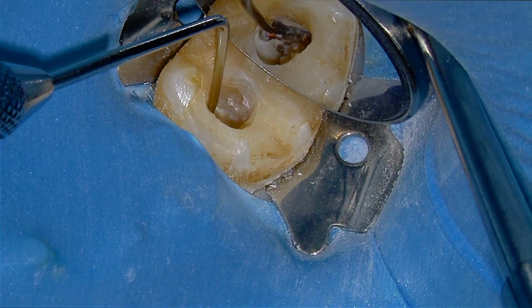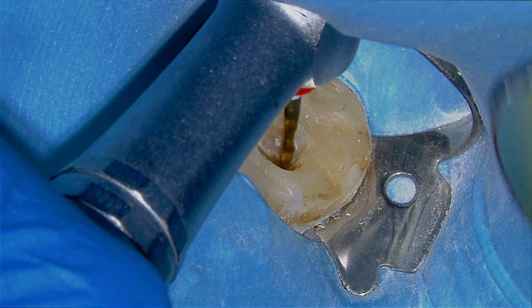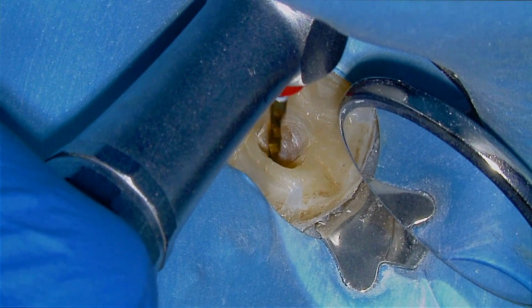It's a really cool tip. Okay, so now what I'm going to do is take my Wave 1 Gold and start to remove some of that gutta percha. But honestly, I find that the reciprocation is fairly inefficient for removing gutta percha.